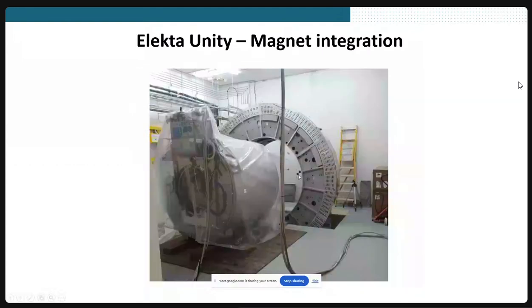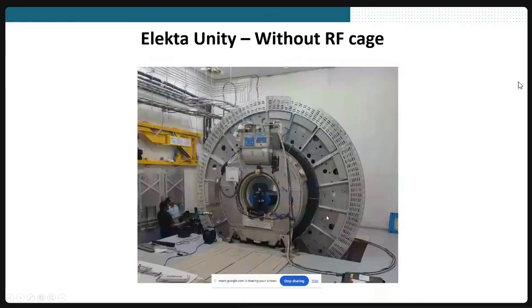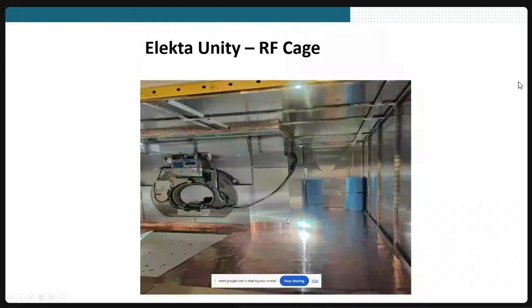So this MRI goes and directly fits into this one. As you can see, this is the pit wherein the LINAC is there, and the MRI goes here, puts 2 legs here and 2 legs here, and then gets attached there. And this is how it looks. So you have the MRI inside and you have the LINAC. So the MRI does the imaging and the LINAC does its work by rotating around the patient. So quite a nice design, and it really works well.